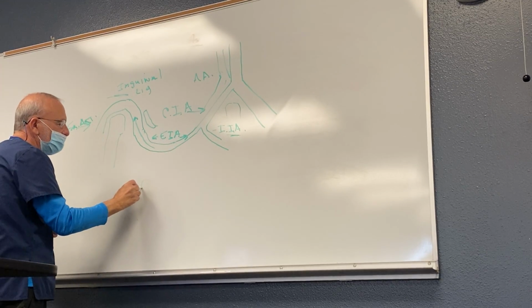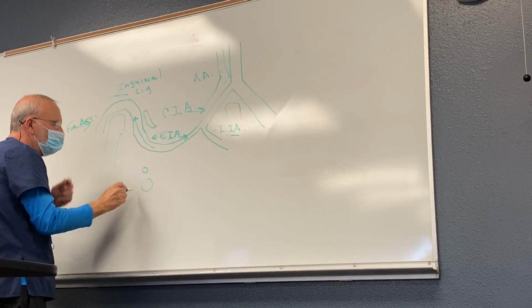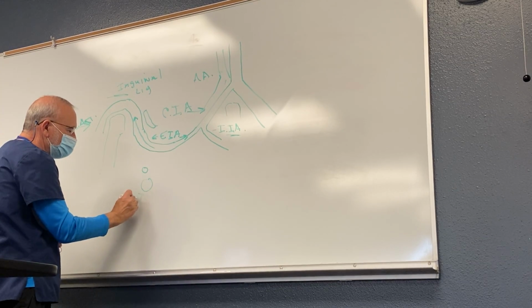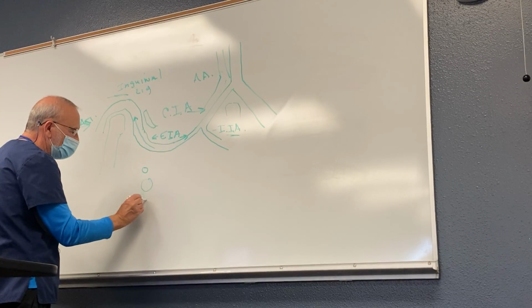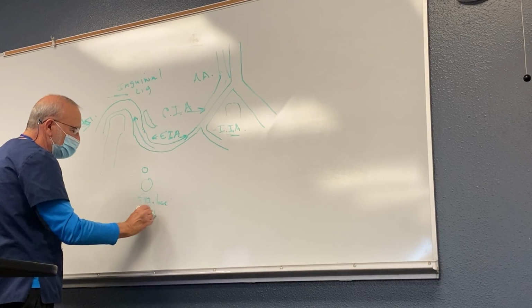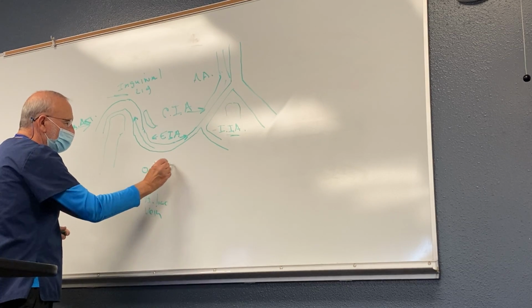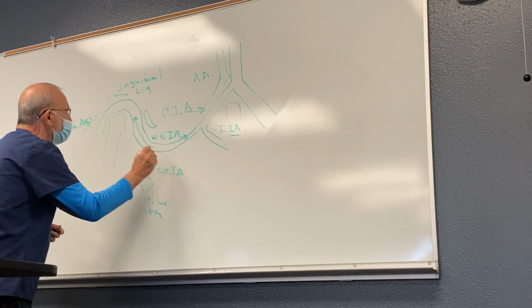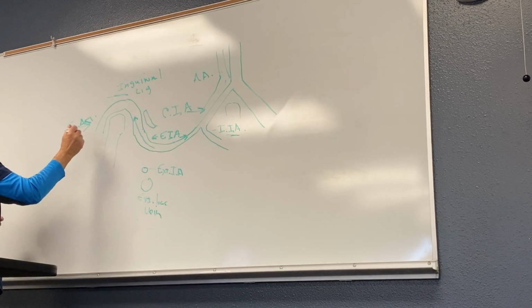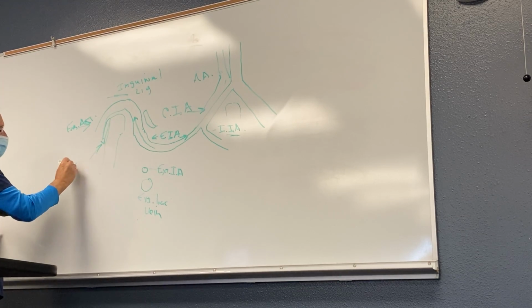You're going to have two structures that will start off before they make that turn parallel, one larger than the other, and one more posterior. So you're going to have the external iliac vein, posterior and larger in diameter, compared to the external iliac artery. When they make that cross beneath the inguinal ligament, now what you'll have, larger posterior, is going to be femoral vein.